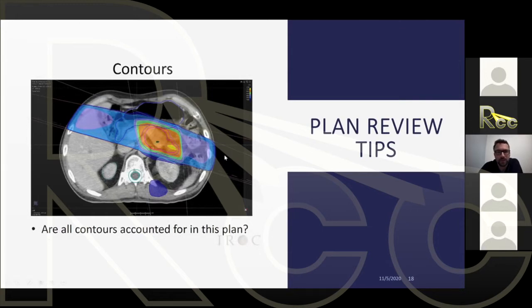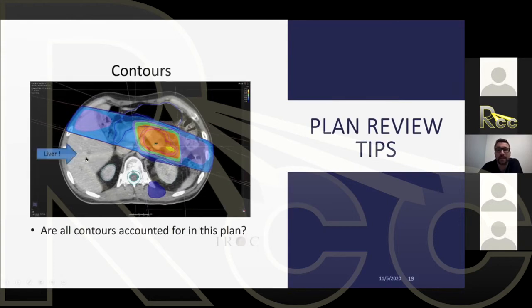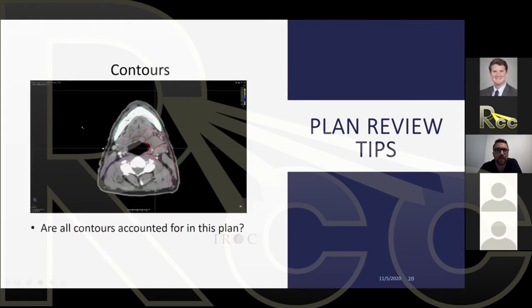For example, here are all the contours of a plan. You have beam arrangement, high dose region, kidneys, spinal cord, stomach — but it looks like the liver is missing. That would be a good example of a missed contour, and it's going to receive significant dose, so you need to report the dose to it.